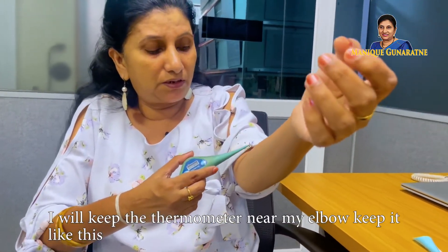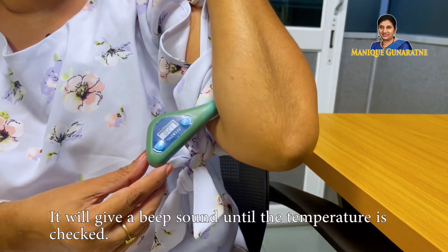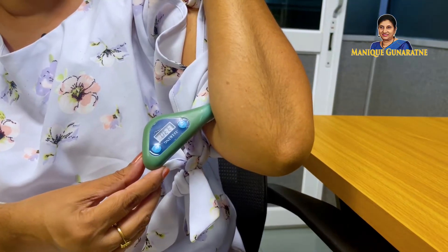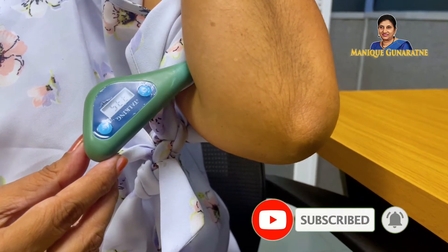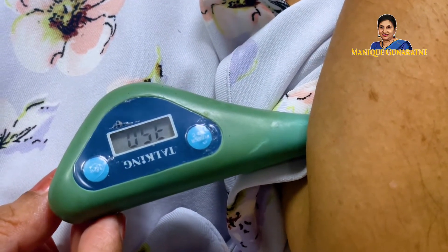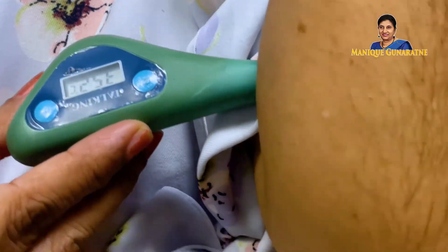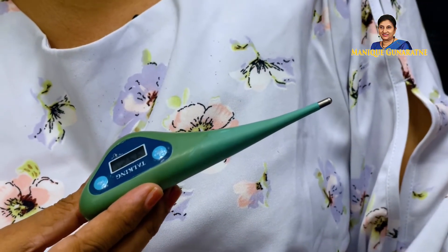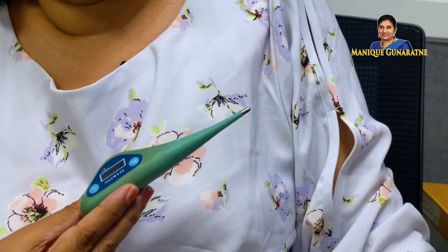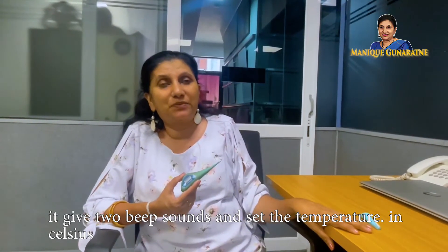You can keep the thermometer either under your tongue or your armpit. But today I will keep the thermometer near my elbow — keep it like this. It will give a beep sound until the temperature is checked. It gave two beep sounds and set the temperature in Celsius.